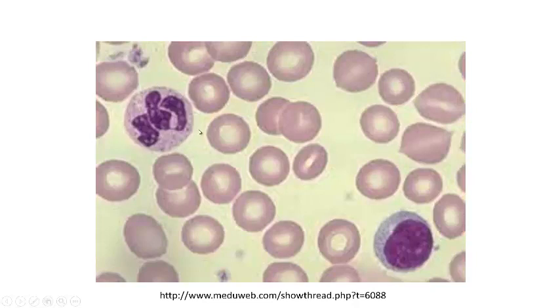And I see another neutrophil just like on the first slide, and we're seeing another slide like this because neutrophils are the most abundant leukocyte and lymphocytes are the second most abundant white blood cell. So it's not very uncommon that if you get a slide you're going to see neutrophils and lymphocytes on them. So here we see that segmented nucleus that you can definitely say, oh, that's a neutrophil.